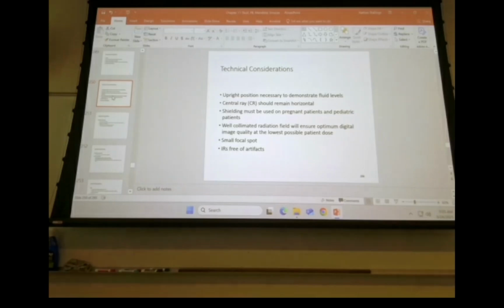So with 11-167, though, you start to see some air fluid levels. They're not clear, though, right? Some of the paint jobs on some of the cars kind of fade, right? They go from black to gray, and it's just kind of incremental. That's kind of what you're seeing there. It's going from very light to very dark, but incrementally. It's light, and then it's gray, and then it's really dark. That's what you get with an angulation, but that's a 45-degree angulation.